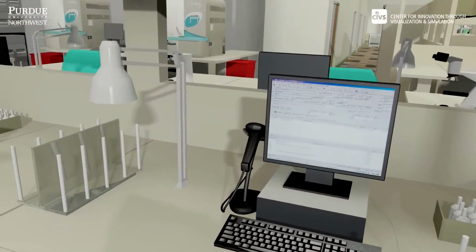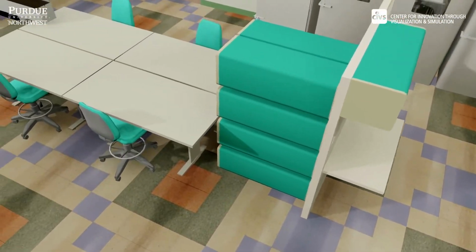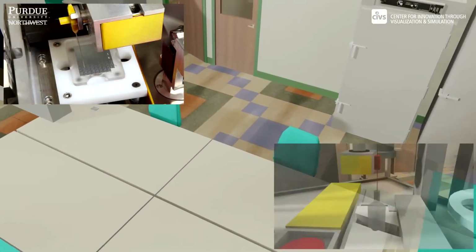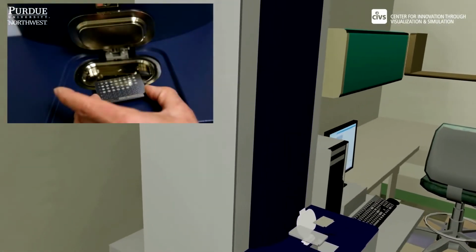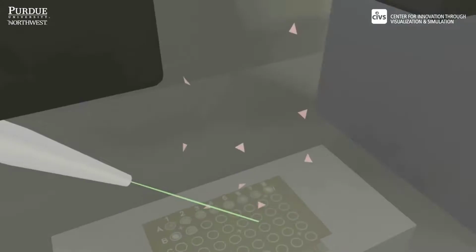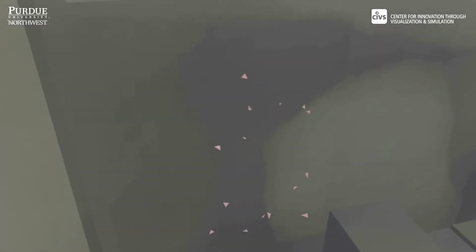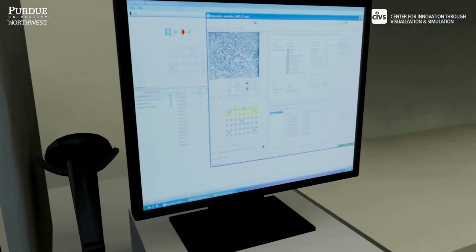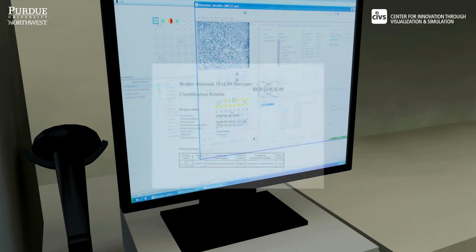Accessing information from the WASP lab computer, the WASP will highlight the colonies from the appropriate plate and transfer it to the Maldi-TOF target circle and inoculate the Prompt bottle for MicroScan antibiotic resistance testing. The target is loaded into the instrument and run. Once inside, a laser is used to vaporize the bacteria, and the different protein molecules travel up a vacuum chamber to a detector at the top. The amount of each type of protein is determined and compared to a database of over 2,000 bacterial species to find the best fit pattern and identify the organism, giving it a name.